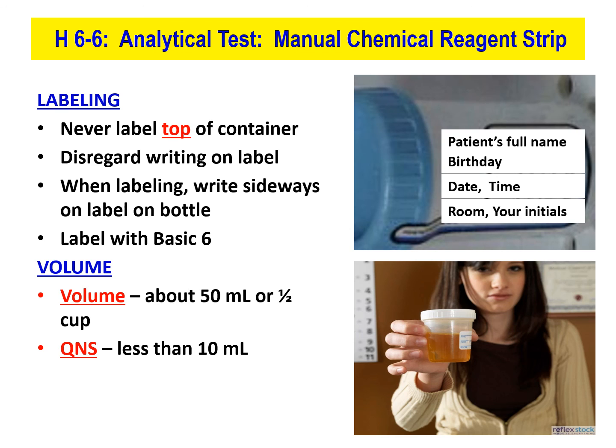information. So when you collect your urine Wednesday morning before you come to class, you will perform a clean catch urine. You will securely put your cap on your container, and then you will put your full name, your date of birth, the date and time you collected your urine, and your initials and room H221 on there. And then you will bring it into class on Wednesday, okay?